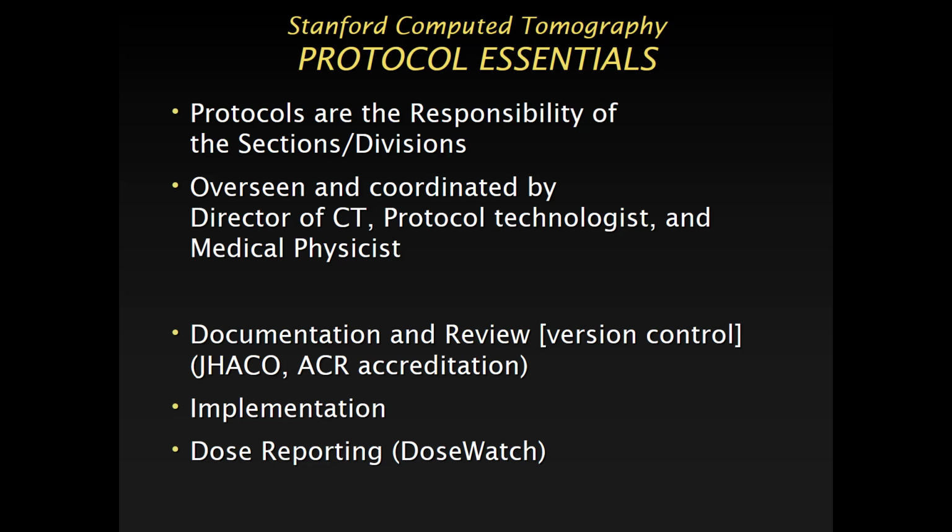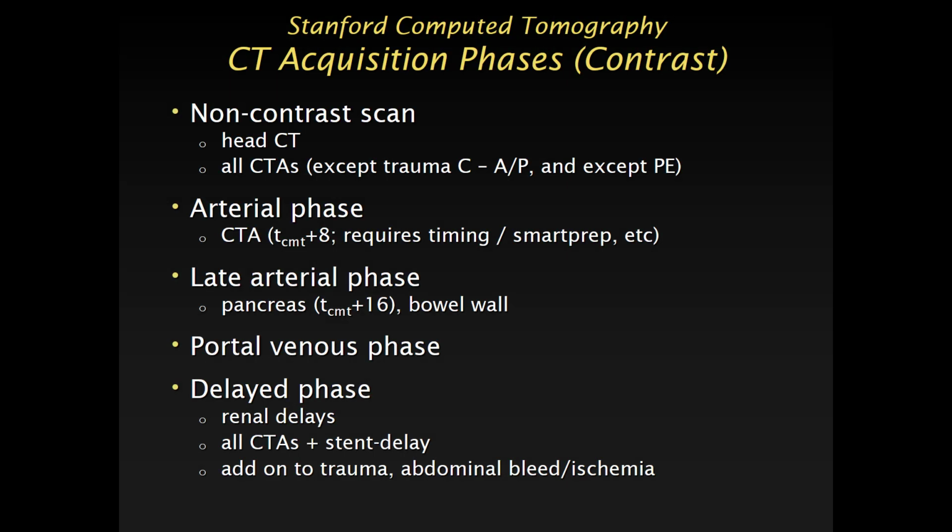So it's not like a little dinghy where you can change direction easily. We are like a behemoth of scanners. It's like the Titanic where you want to change course, and once in a while I'm afraid we're hitting some icebergs. Now, also it's important that the protocols are somehow linked also to our dose reporting, as we just heard from Ja as well. Now, just a quick word.